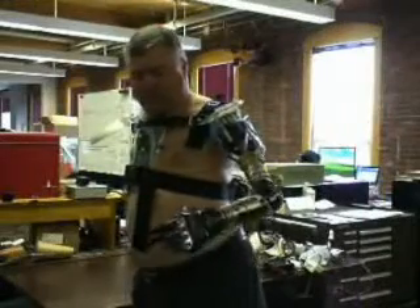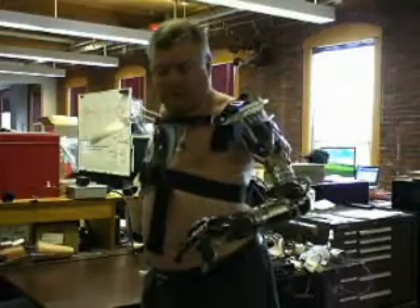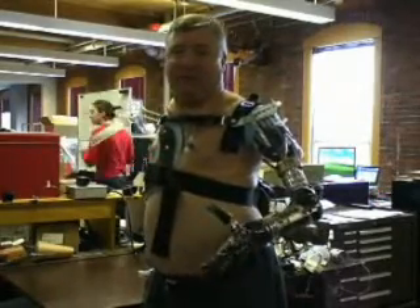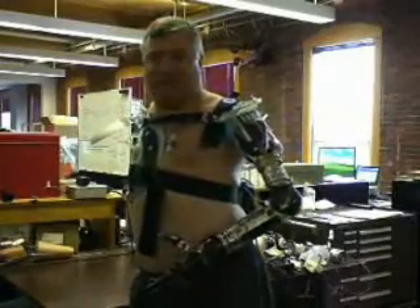I've been able to do stuff with this that I even seriously haven't done in 26 years. Like what? Pick up a banana — a peeled banana — and eat it without squishing it. The payback we get is when somebody like Chuck says, I fed myself for the first time in 26 years.